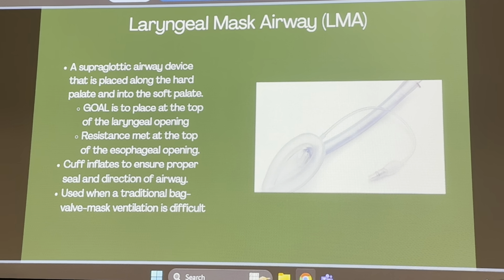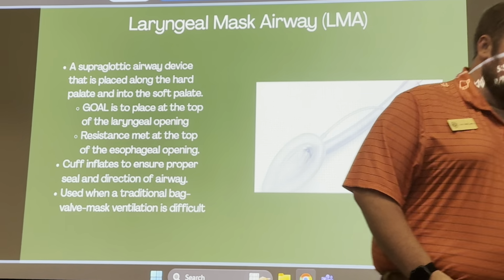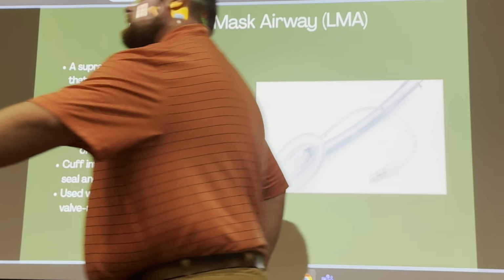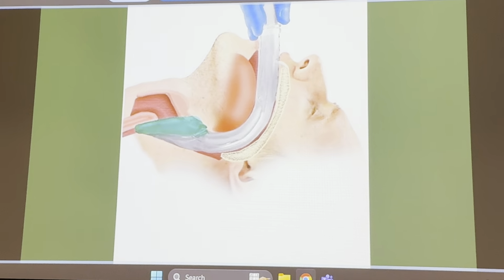Then we have what's called a laryngeal mask airway. So I have a couple different of these. This is more of a supraglottic airway.